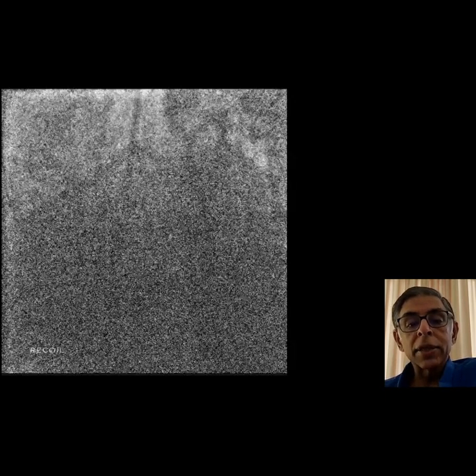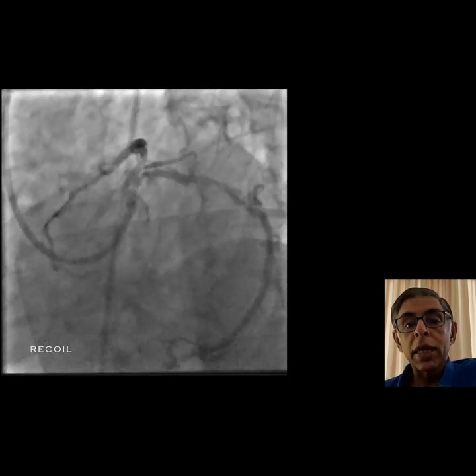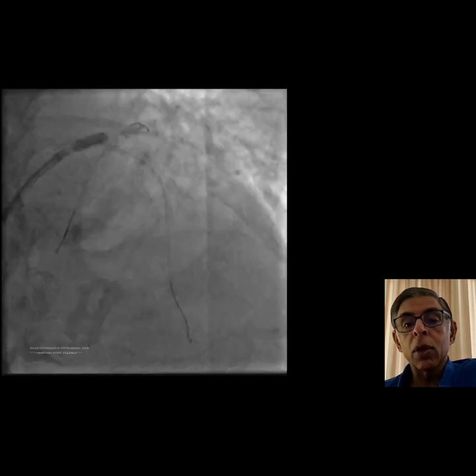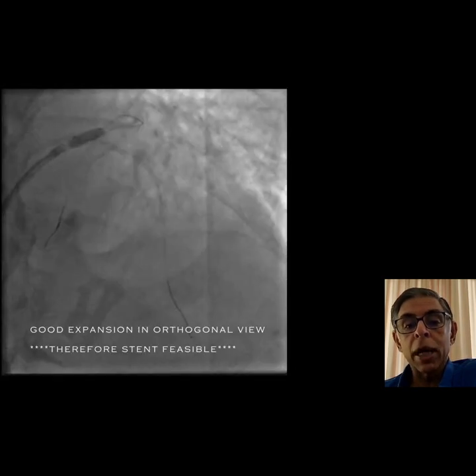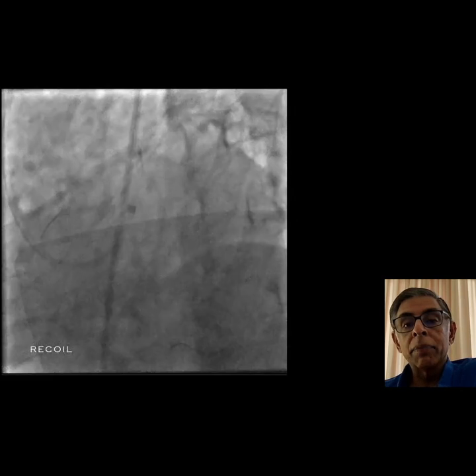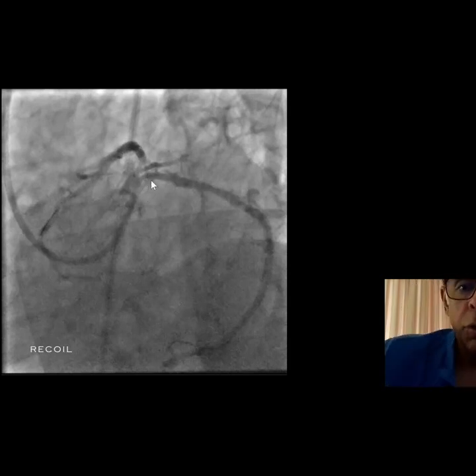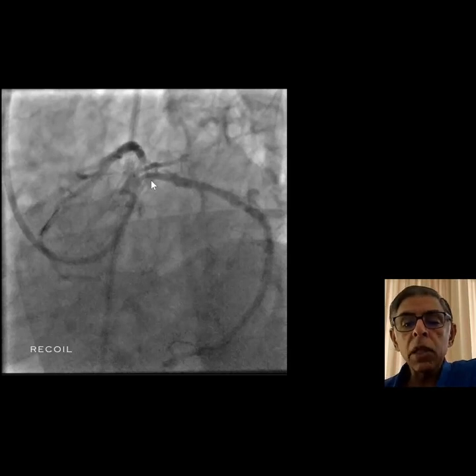And we did consider the option of drug-coated balloon angioplasty, but you can see that there is pretty significant recoil. And again, I'm going to let this play one more time. You can see that, even after a ton of ballooning, even a 3.5 Scoreflex balloon at 26 atmospheres, there's quite a bit of recoil. So while drug-coated balloon would be another option here, we opted to not go that route.